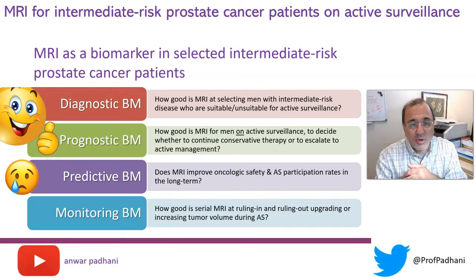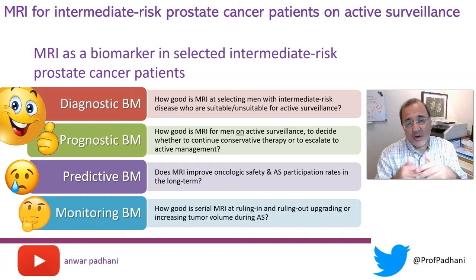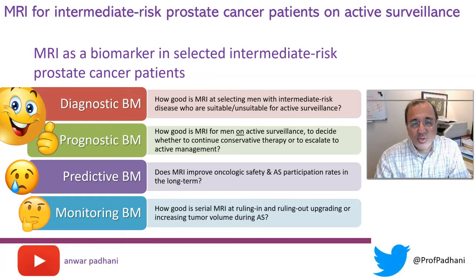Regarding its predictive role, we're asking, does MRI promote oncological safety and long-term participation rates? And for monitoring, we are asking the question, how good is serial MRI in ruling in and ruling out grade or volume upgrading during the active surveillance process?